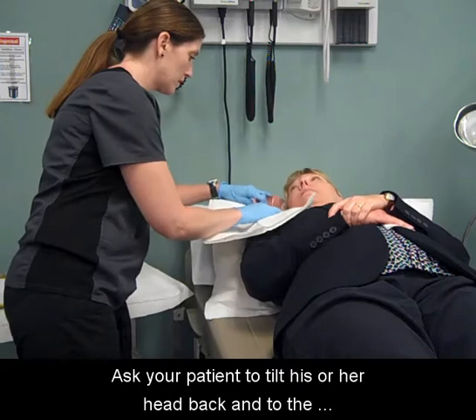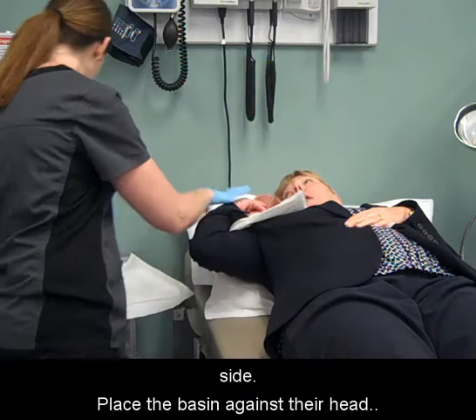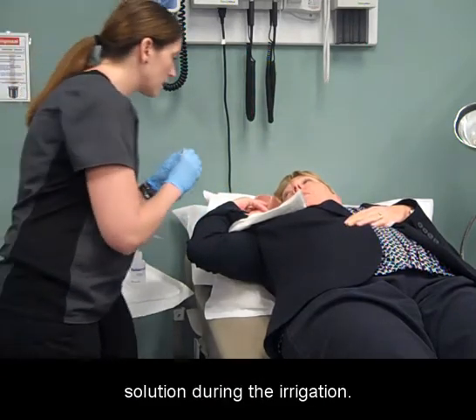Ask your patient to tilt his or her head back and to the side. Place the basin against their head. Instruct your patient to hold the basin to catch the solution during the irrigation.